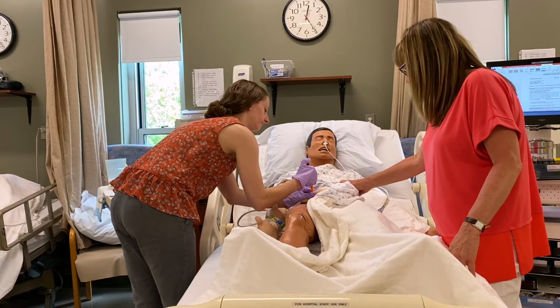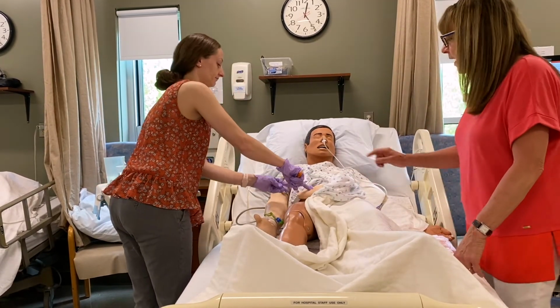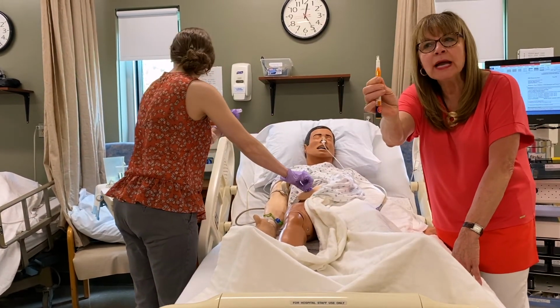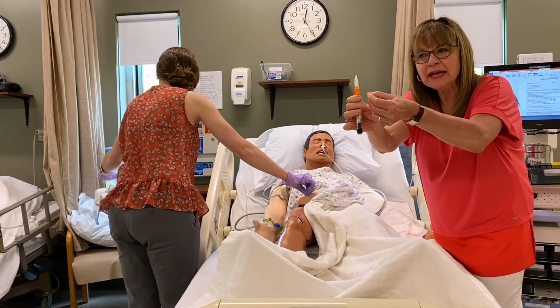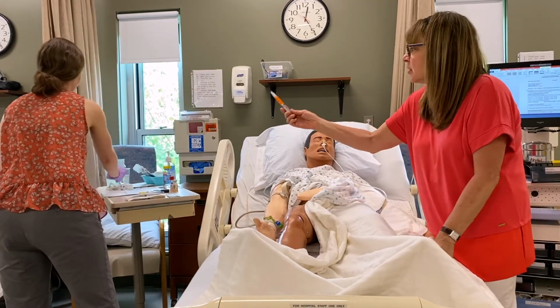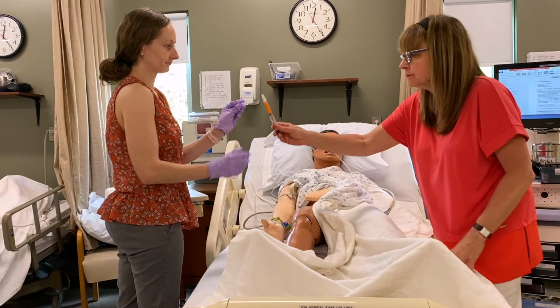Pausing. And your alcohol wipe is right there. Great. Okay, and you will know that you've given the medication because the window is now red. The needle retracts in, so she can take it off. This way, it's not going to prick her, and then all that's thrown away is this, not the pen.